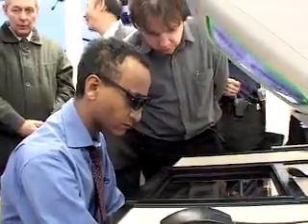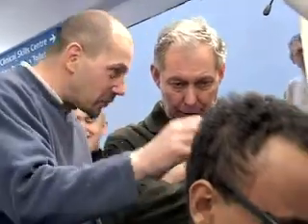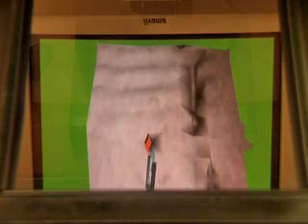Surgeons were able to test the prototype of the simulator at a conference in continuing medical training held recently at the university's medical school, and were clearly impressed by the feel of the experience. The simulator is particularly effective in that it is able to make cuts in the graphic-generated brain, something that previous machines have been unable to do.